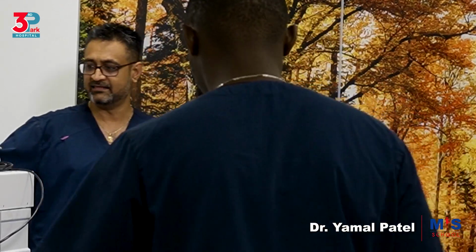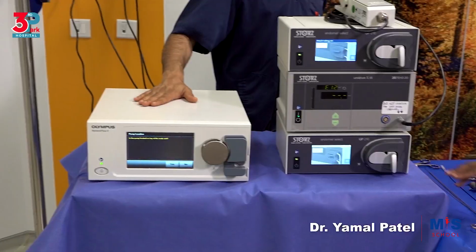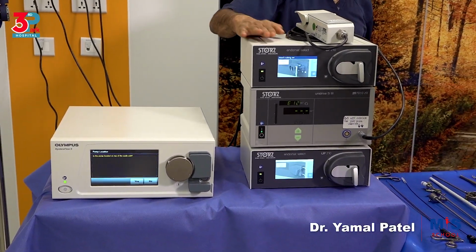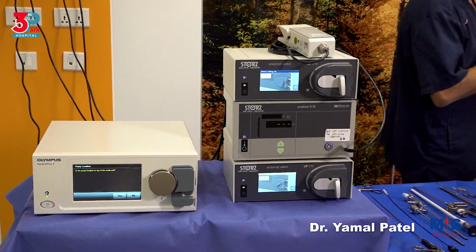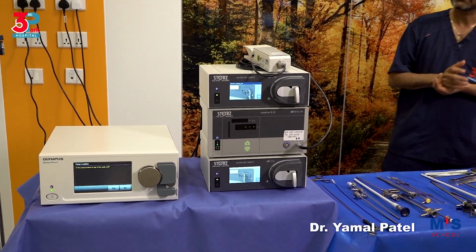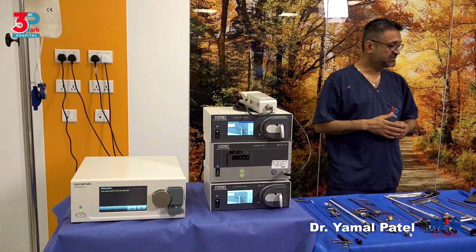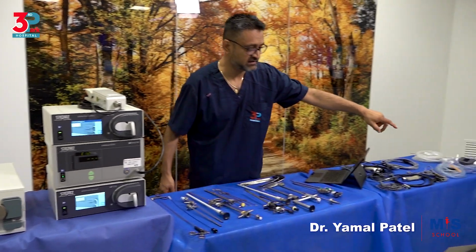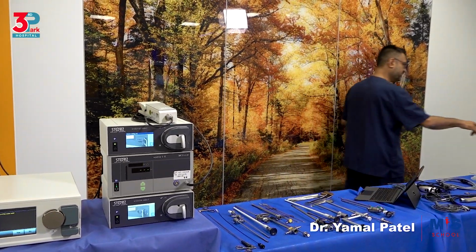We have the fluid management system. In this case we have the fluid management system. We're going to go through these one by one. Fluid management systems of different companies appear differently. They're all serving the same purpose, but we'll discuss more in detail about this. We have a suction machine, which is the regular suction machine out there behind.